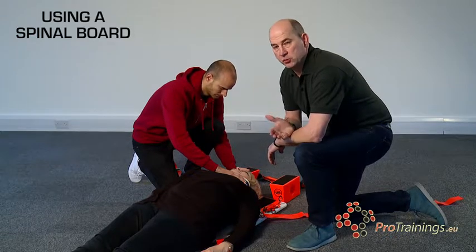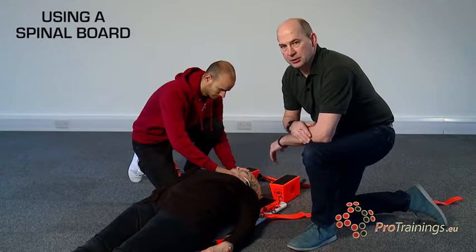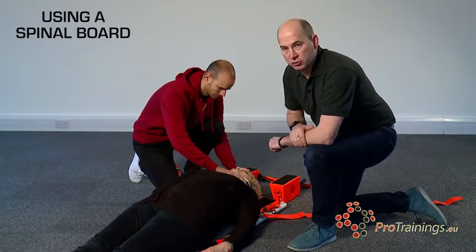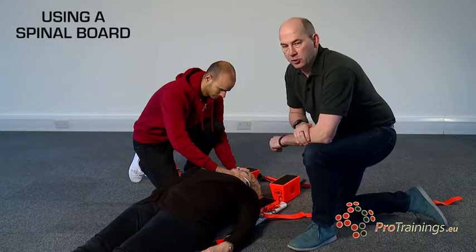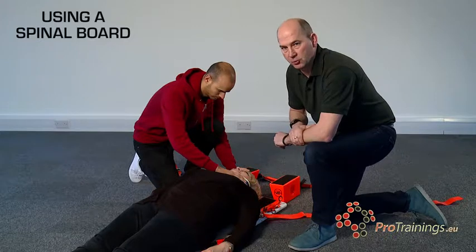Attaching a patient to the spinal board or backboard, there are a number of different ways of doing it, but the most common way is a cross method with the straps across the chest, then the final one across the legs, finishing off always with the head blocks at the top.